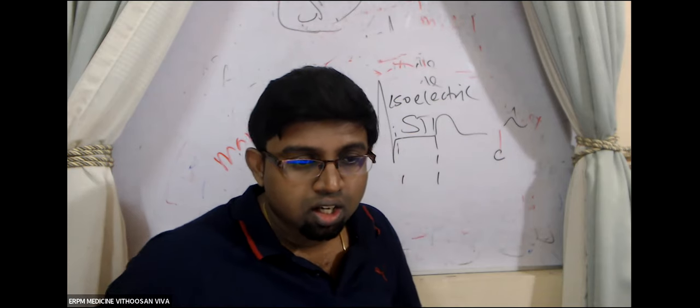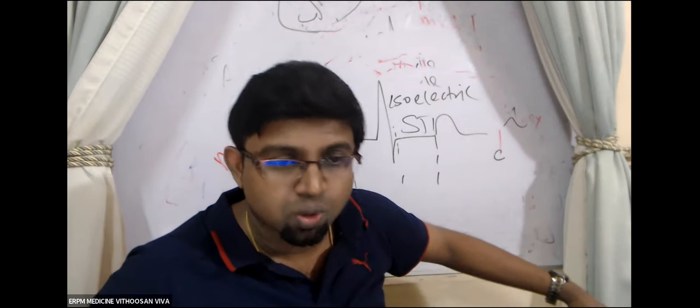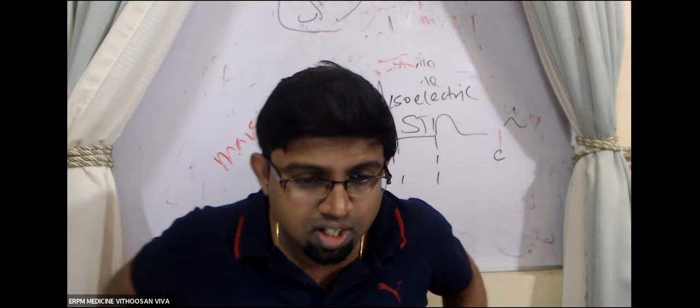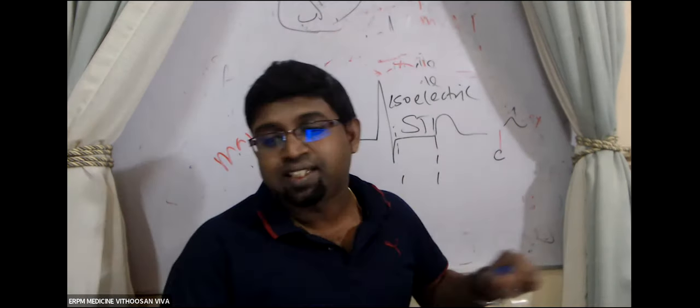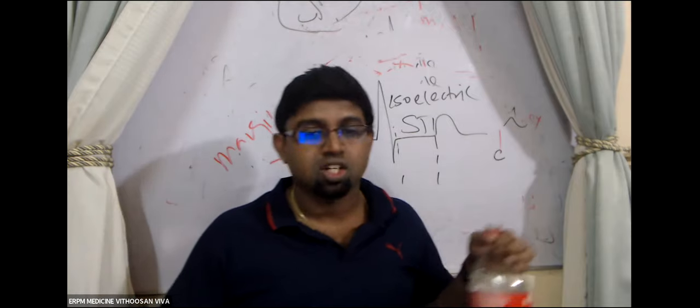It should not go up. It should not go down. Clear? If it goes up, we'll study in a few minutes, that is called ST elevation MI. If it goes down, you will say that is ST depression.